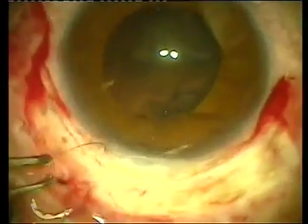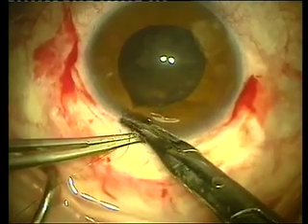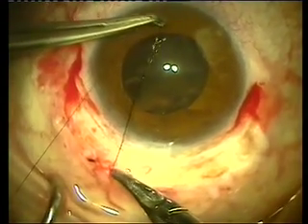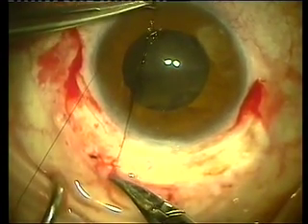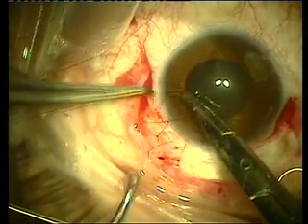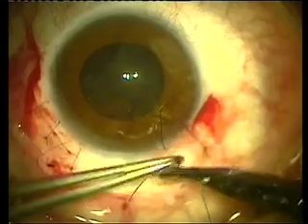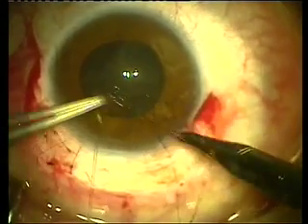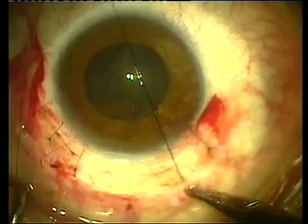Several sutures are placed to re-establish the integrity of the globe. Fortunately, the preparation of the incision seen previously will make very few sutures necessary to get a very good watertight wound. Specifically, only seven sutures will be used eventually.